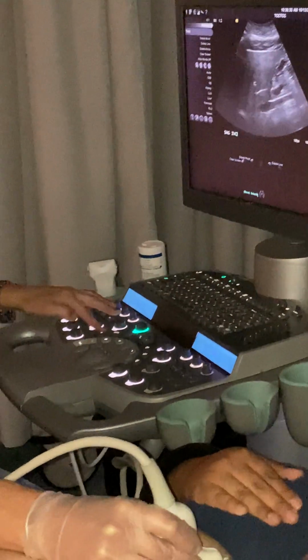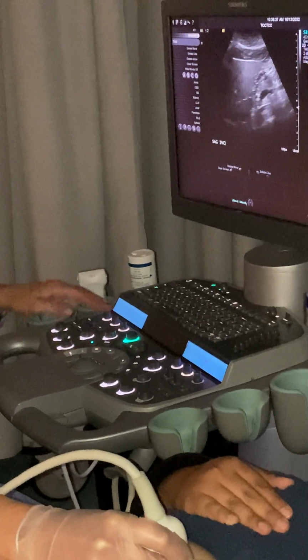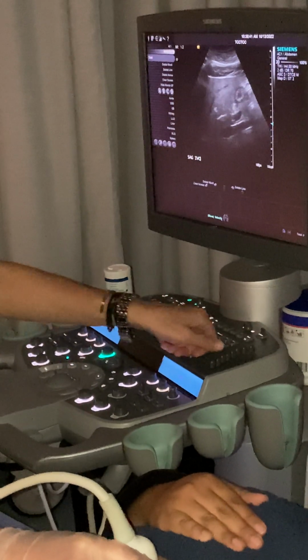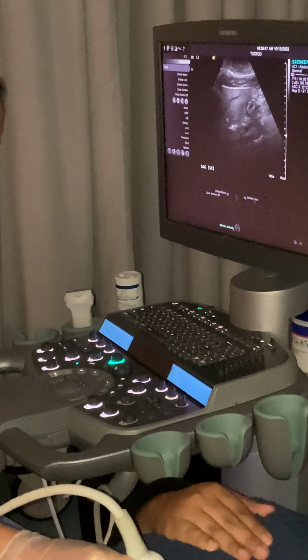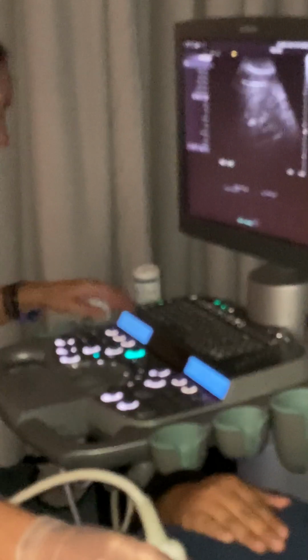Come on. What did I do? What is that? What did I do? I don't know what to do. Run harmonics. Okay. I hate this machine. Well, I don't hate it, I'm just not very used to it.